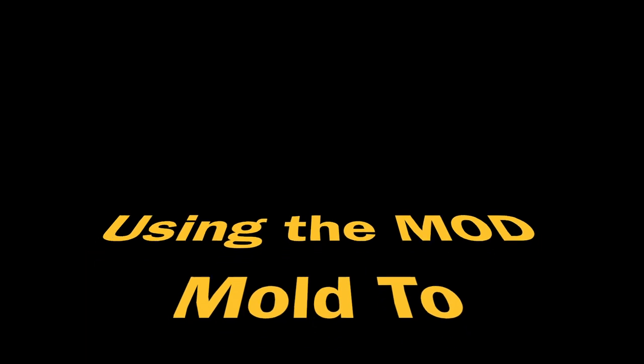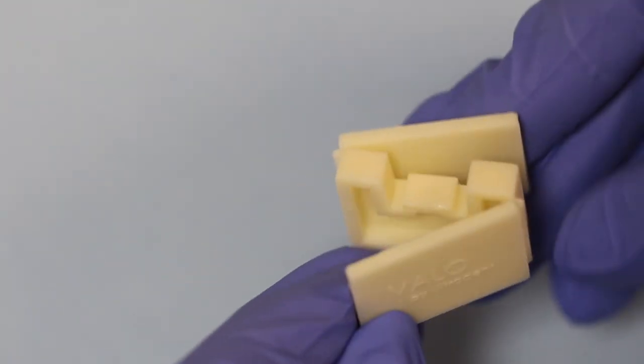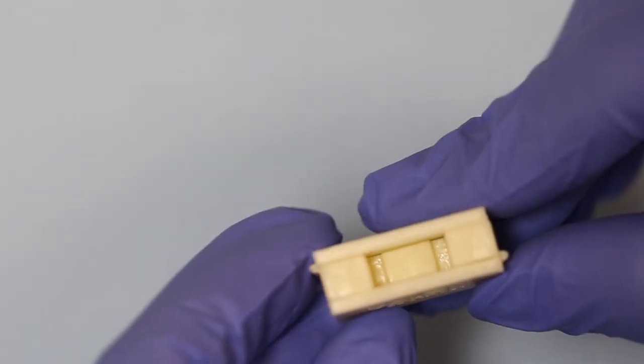This video illustrates the use of a previously described MOD plastic mould that is available from Ultradent. This mould comes as a one-piece piece of plastic which folds up on itself to produce an MOD cavity.